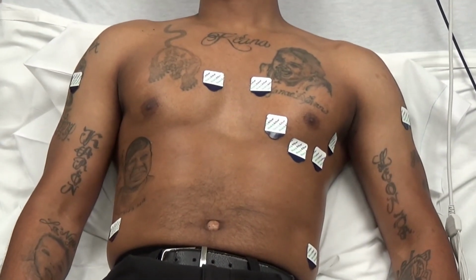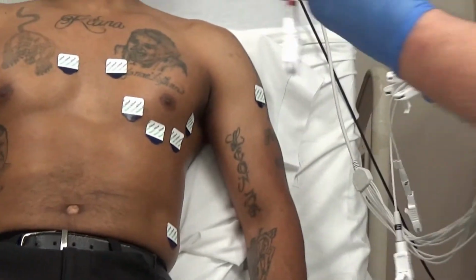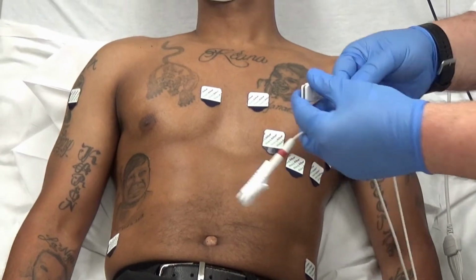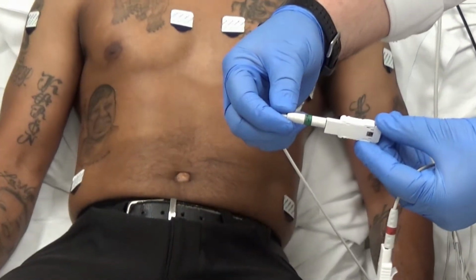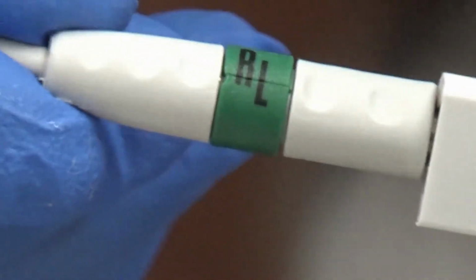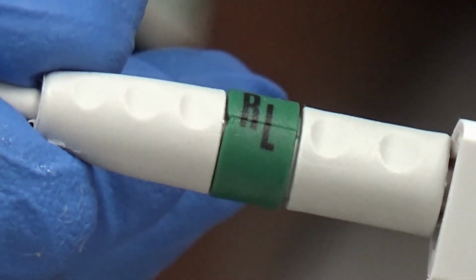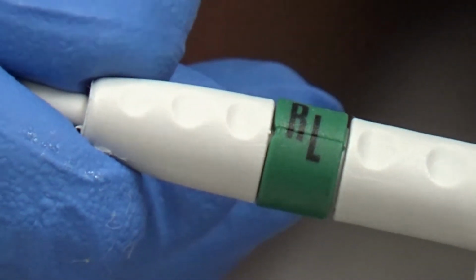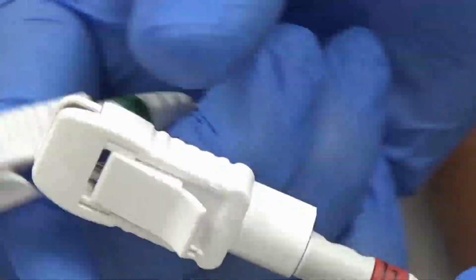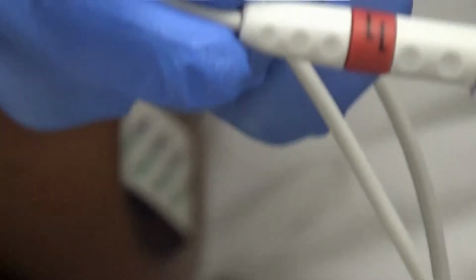So now we will actually put the leads on the patient. Just show the probes there real quick because they are labeled. Each of them will have that marking on there. Right lower limb. So this would be your right lower limb, and each one of these is marked.